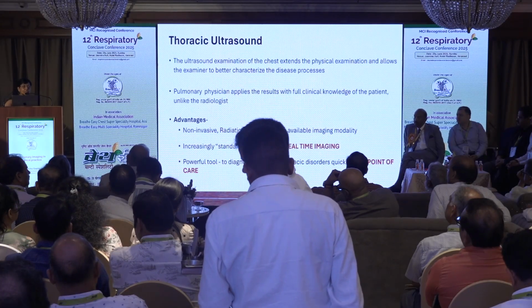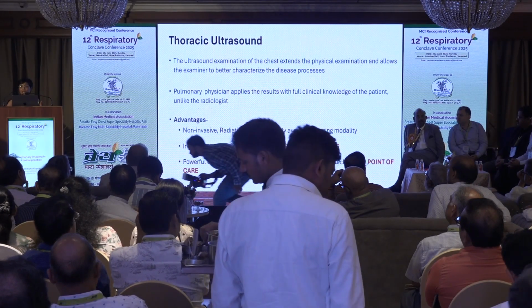It has improved the standard of care, and I would advise everyone, no pleural procedure should be done without having an ultrasound probe in your hand. Now, I am a person who comes from where we used to do pleural procedures based on our percussion skills and on chest X-rays and lateral chest X-rays, but things have changed. Lots of litigations are there. So please, please be careful, make use of ultrasound, and I can tell you, I feel that I can survive without a steth now as a pulmonologist, but it is very difficult for me to survive without an ultrasound.